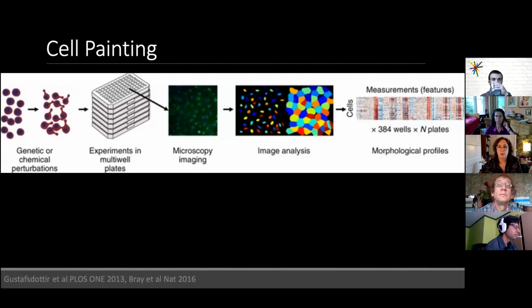researchers were looking for a way to identify biological patterns across many samples of the same experiment by extracting quantitative data from many microscopy images. And this is also an important innovation in advancing the use of microscopy research in basic science, because researchers will often just use microscopy data qualitatively in studies to show a phenotype.